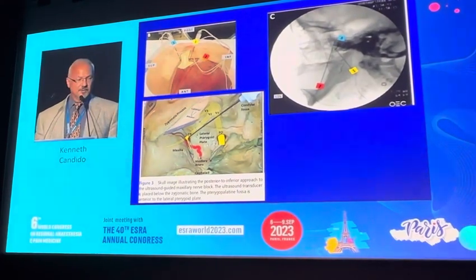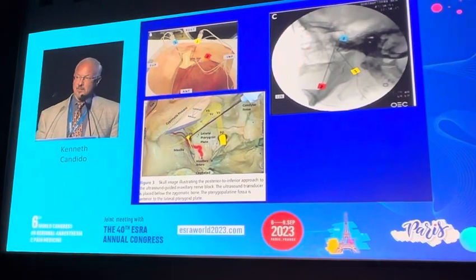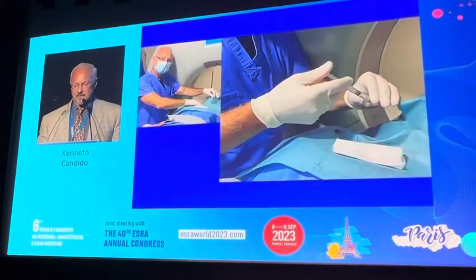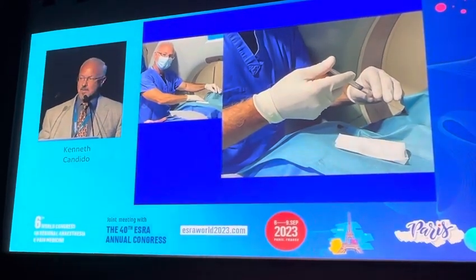I have some of his patients available to me. They come to my pain clinic every now and then. Sometimes these blocks take up to 45 minutes. I do these procedures exclusively under the use of CT imaging and with 3-dimensional reconstruction.